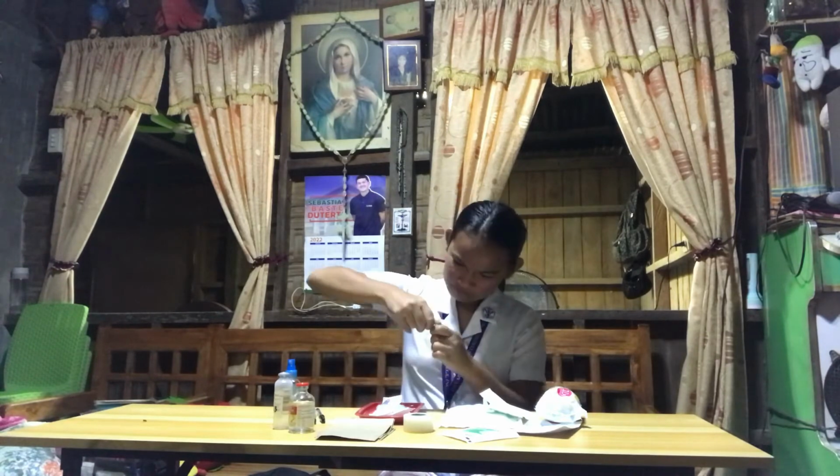Next we place a gauze pad around the neck. Then we snap away the neck with the use of our hands. Finally, we can now withdraw the medication using the syringe placed on a flat surface.